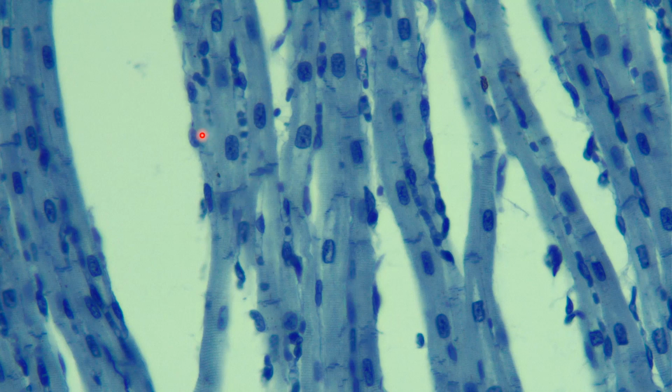We also have striations though. So both skeletal and cardiac have striations. The difference again is going to be, where is the nucleus located? Is it off to the side or is it dead smack in the middle? Dead smack in the middle, you know you're looking at cardiac. Also, they are not very parallel. They kind of branch off and they bend a little. They take these various shapes. There are large gaps between them. So that's another thing to tell you it's cardiac.